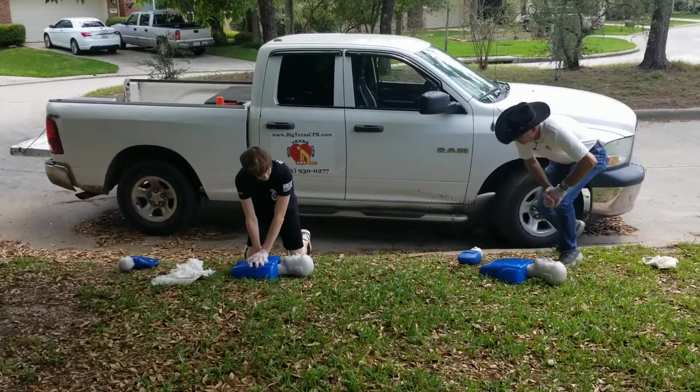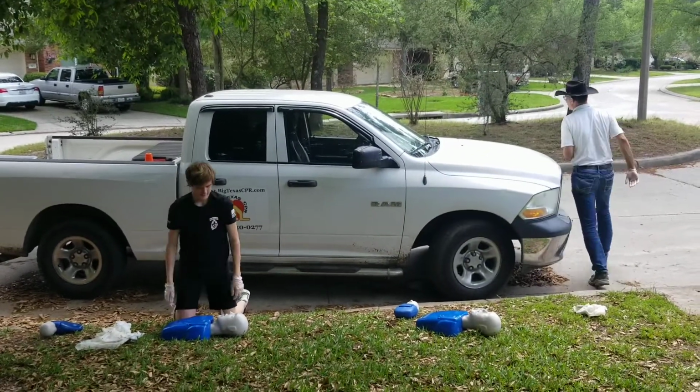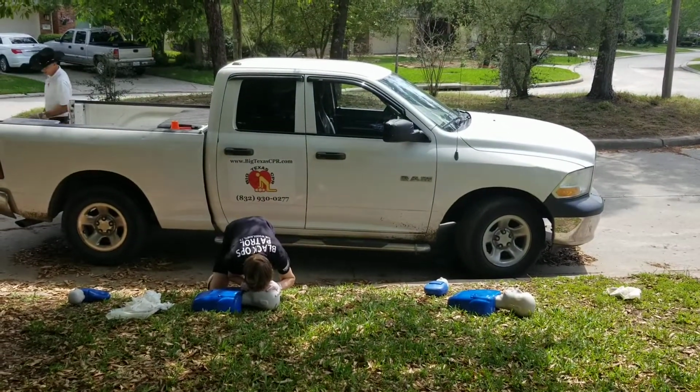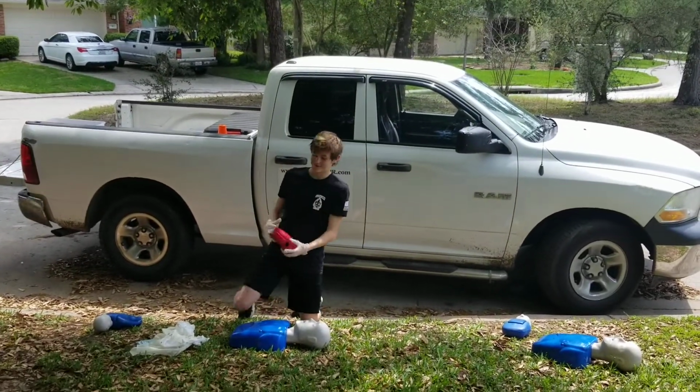Now you call 911 and you ask someone to get you an AED. We'll keep doing that. Hey Ray, found your AED. Thank you.